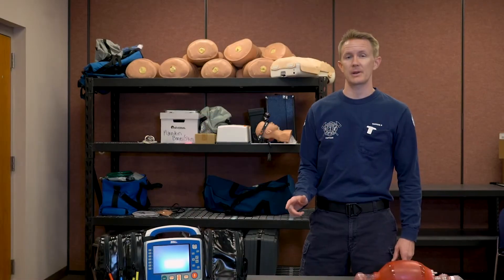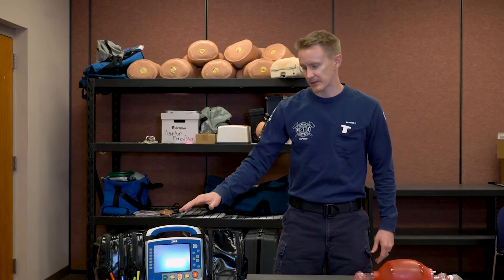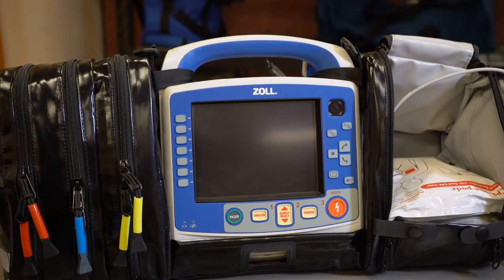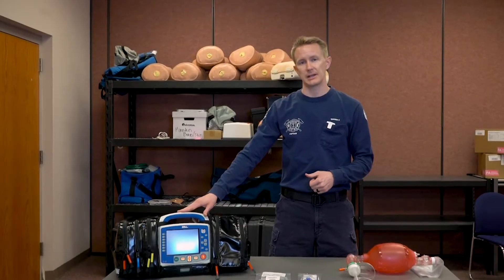Hey guys, Captain Paramedic Tanner Perkins here with the EMS Division. Today we want to talk about the X-Series Advanced and the new functions that we have now with this monitor — both the real-time feedback for BVM and the TBI dashboard.